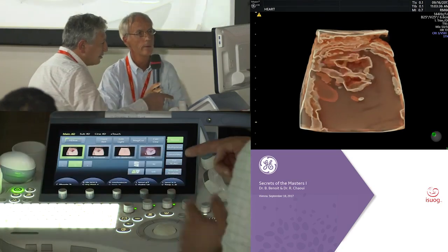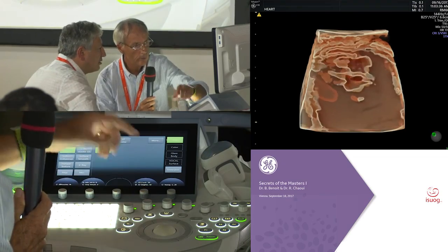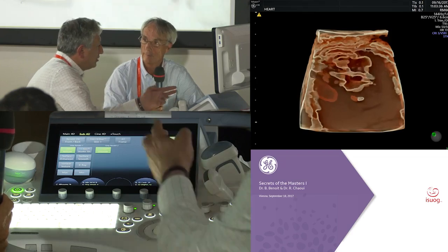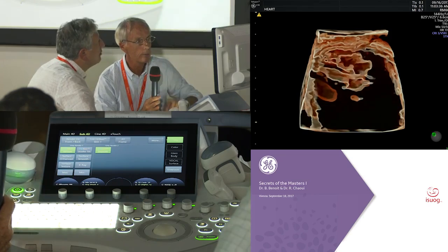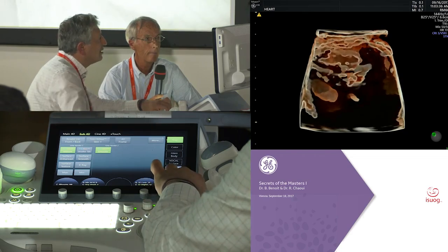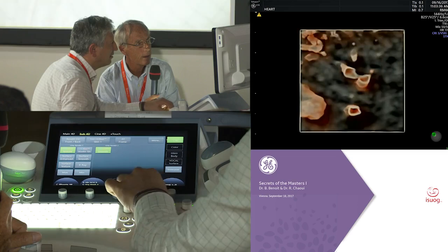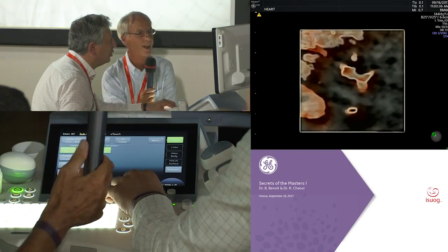So play with it. But you did something different with the gray. What is this? Yes, it's brightness. It's better to have more contrast. That means you increase the contrast and you reduce the light. And if I choose inversion mode, and this silhouette was not to the maximum, and this is with the maximum. And if we choose here, wow. You see, now I'm moving into the inferior vena cava. And you can see the aorta here. Aorta, vena cava. Like a fish saying hello, hello, hello.